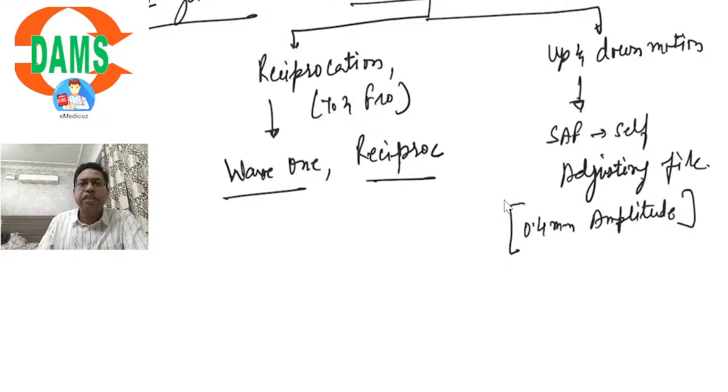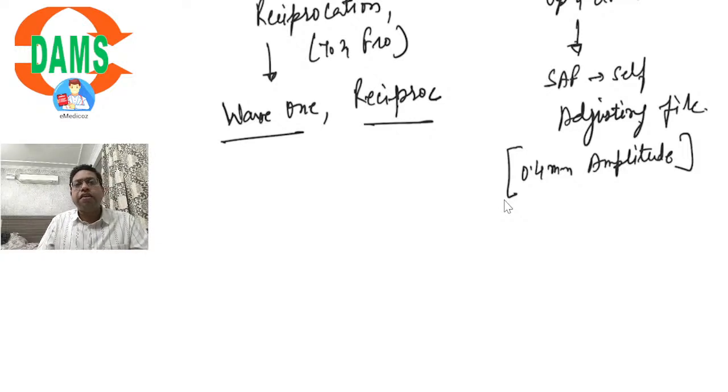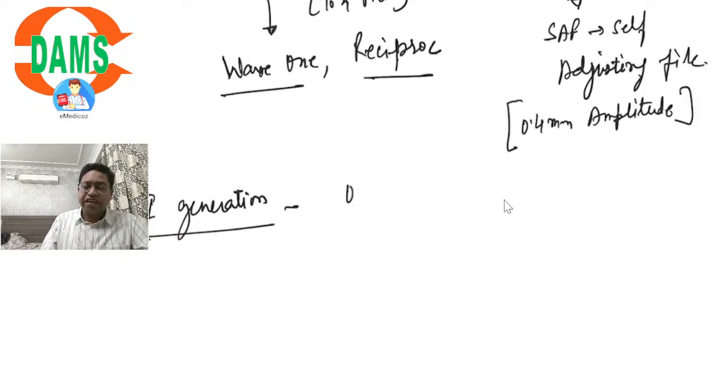So basically what you have to understand is that nickel titanium instruments are classified into generations depending upon their principal characteristics. The first generation were the passive ones, second generation active ones, but both were using simple complete rotary motion. In the third generation, a special heat treatment was given to the instrument to increase its fracture resistance and cutting efficiency. Fourth generation, alternate motion, either reciprocation or up and down. And finally, fifth generation instruments. They have offset design.